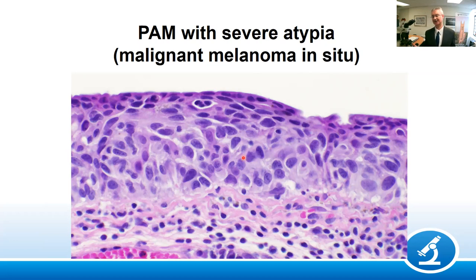You may ask, can you misinterpret or confuse this with squamous cell carcinoma in situ, as we showed earlier in the talk? And the answer is yes. And if you ever have doubt, please just do some immunohistochemistry. Not all melanocytic lesions will be pigmented. The pigment might be difficult to find. And you can get fooled by a squamous proliferation. So ever in doubt, just use your immunohistochemistry.